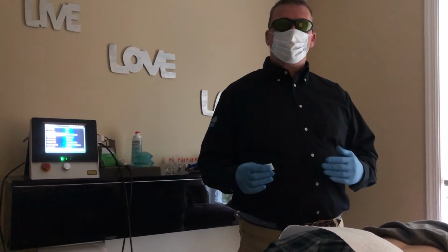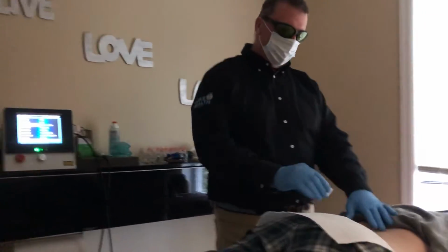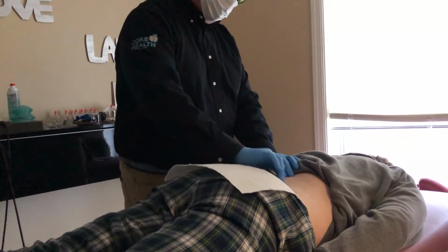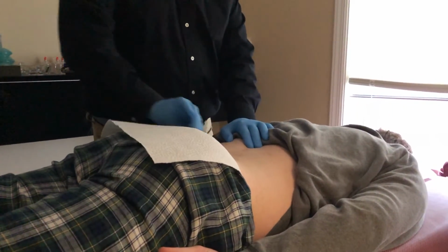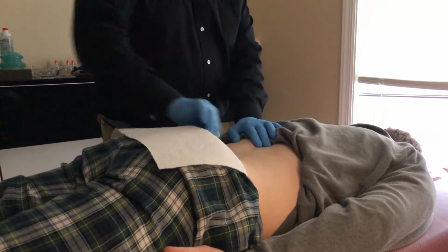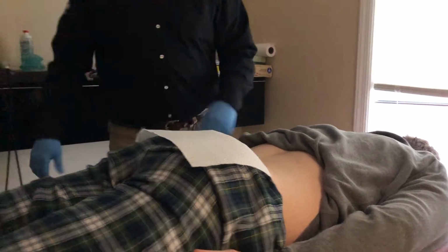I want to demonstrate for you today laser for low back pain. First, we're going to prep the patient with an alcohol pad. I'm going to clean off the back, the area. This is a low back case, so we're going to be focusing on the lumbar area. Once we clean off and sterilize that area, I'm going to go over to the laser over here.